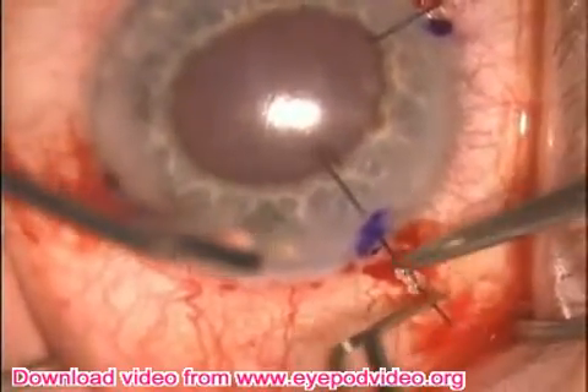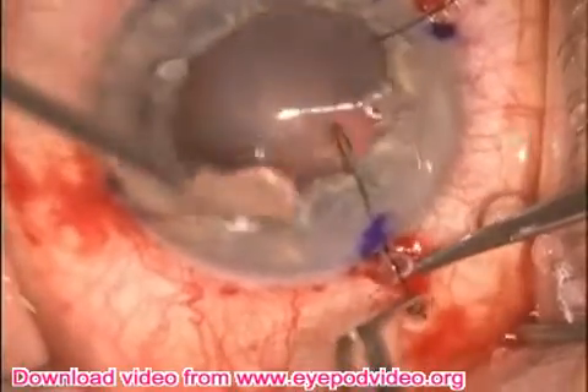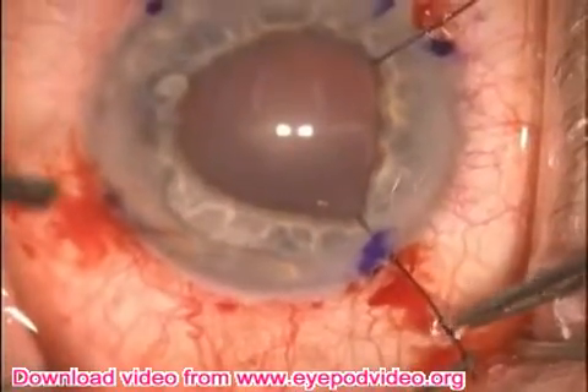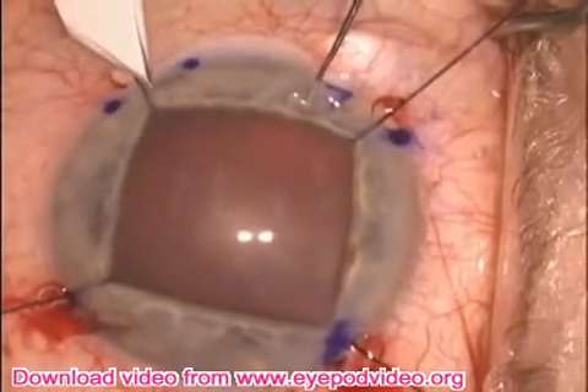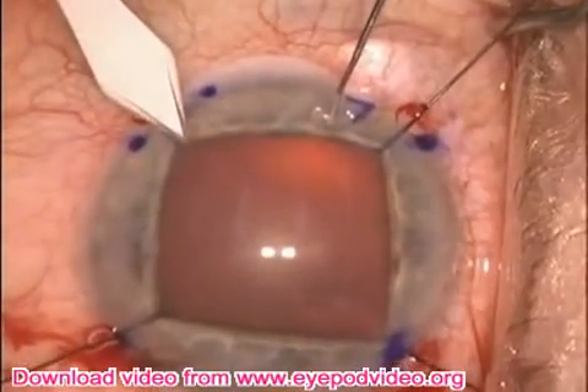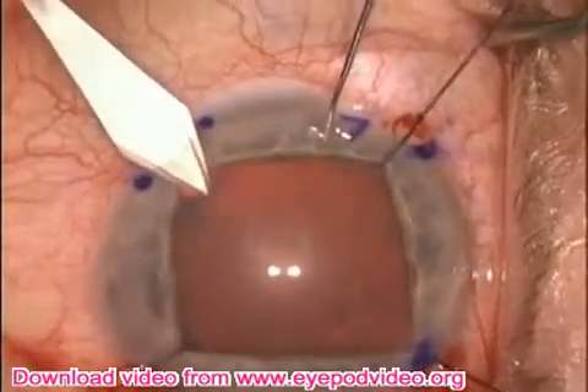Here's another hook. You can see how you can use the two hands together to rotate the hook around and get onto the iris. I tend not to use viscoelastic during this step — it makes it easier. Now a kuglin hook is being used to fix the eye, and the keratome is just anterior to the iris hook and enters the eye.